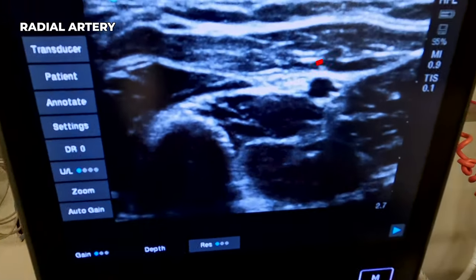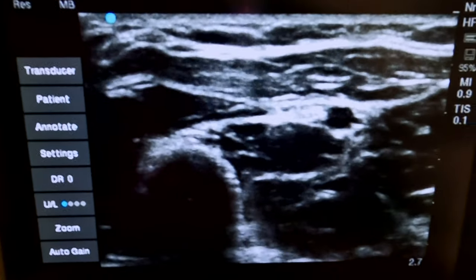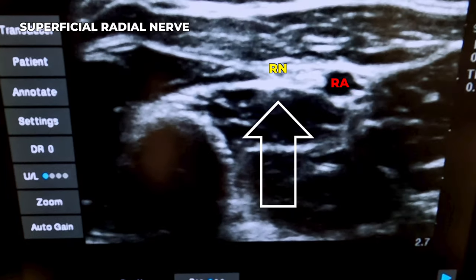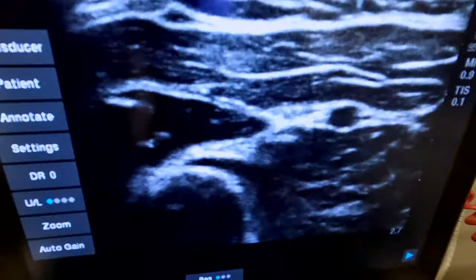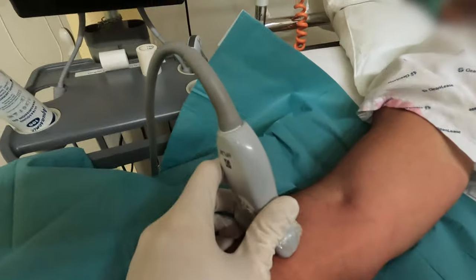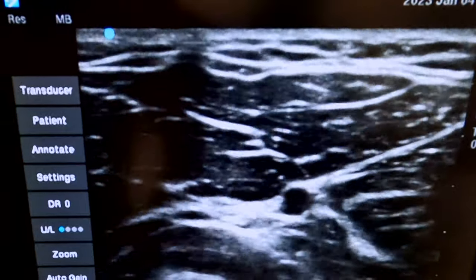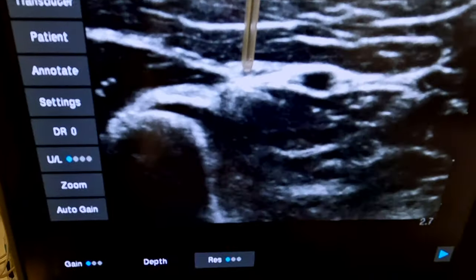Here we can see the radial artery quite nicely on ultrasound, and next to the radial artery is the superficial radial nerve. Let's scan proximal to distal and follow that nerve, seeing how it behaves. As you go more proximally, you can see how the nerve and the artery dive deeper. Going more distally, the nerve comes up to the surface.